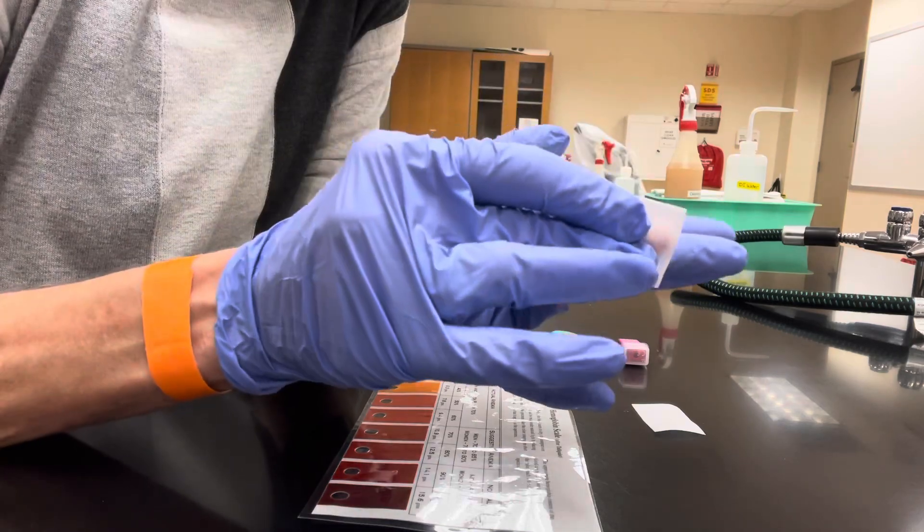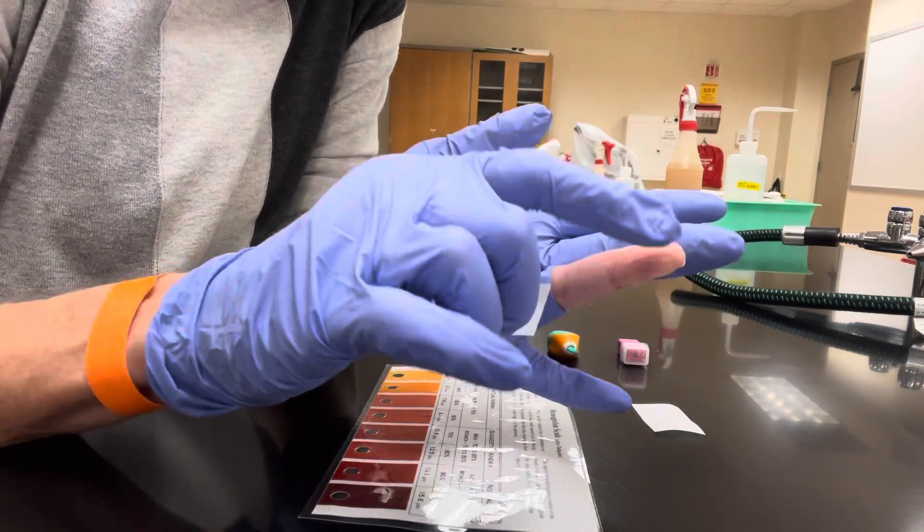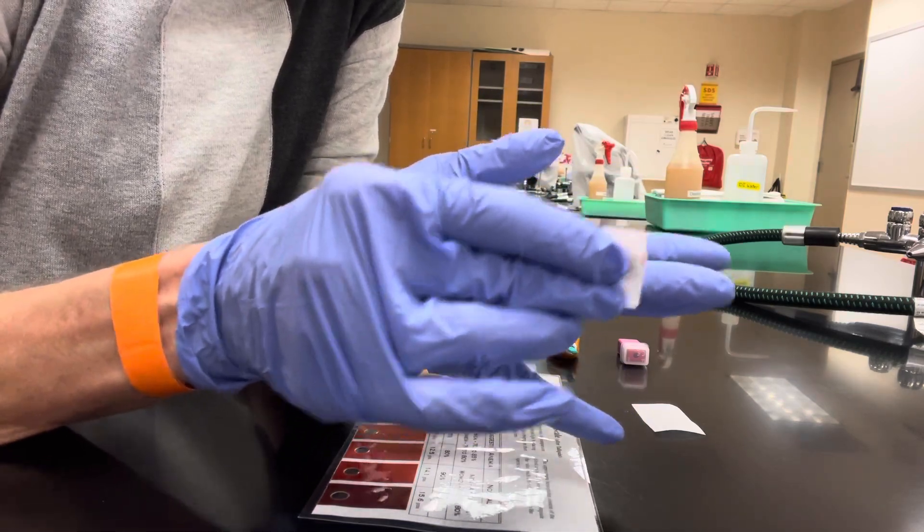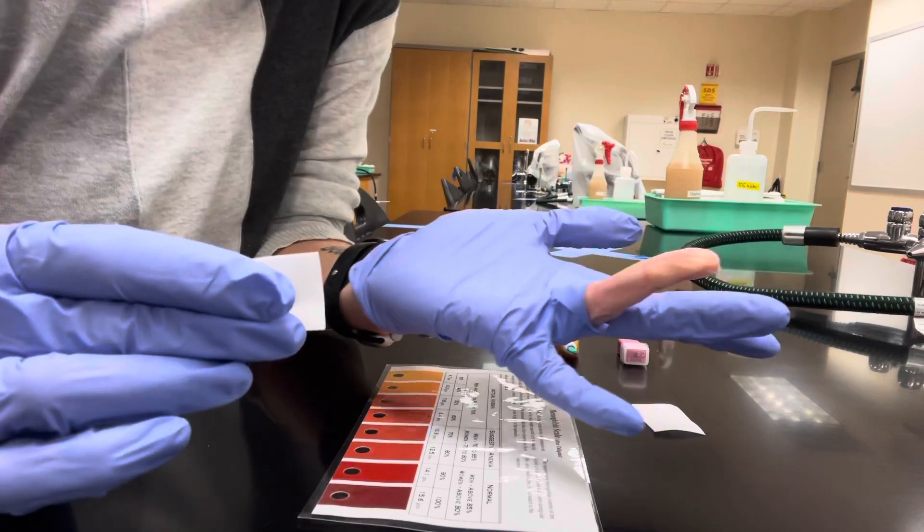It's best to do it from the side of the finger. You don't want to do it from the very top of your finger pads. So you do it from the side, wipe, and then allow it to air dry.